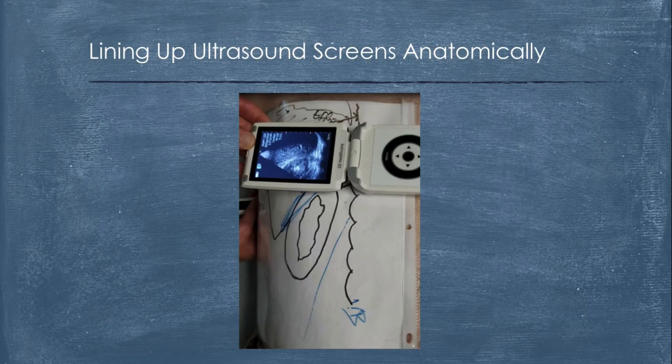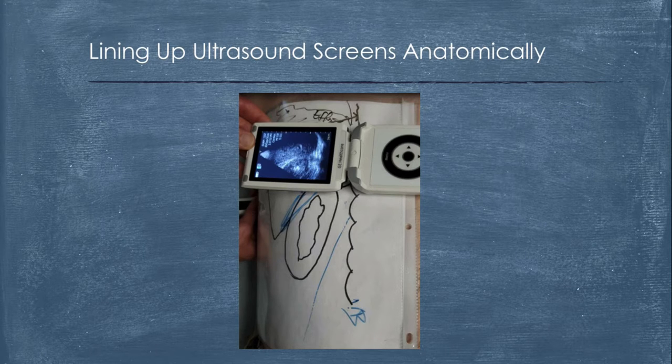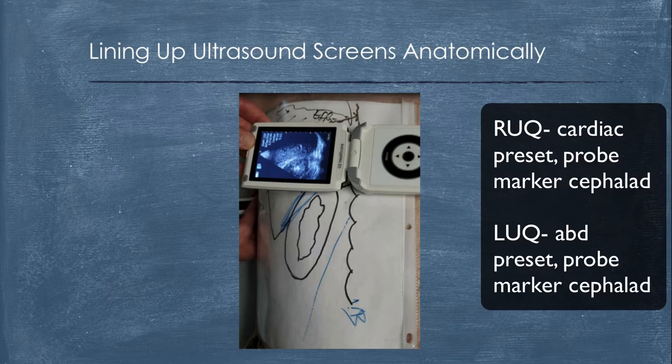Another tip that you can use is if you're using pocket-sized ultrasound machines or machines that use tablets for screens or phones for screens, you can line those screens up so that things are anatomic. And so those small ones can be adjusted and it's fun, kind of like Superman vision, and the patients really seem to like this very technical sort of look inside their body.